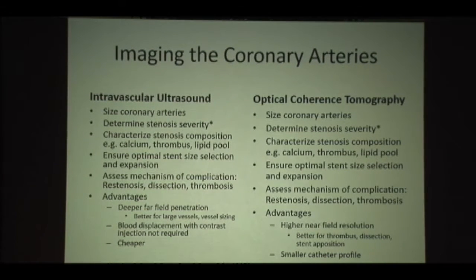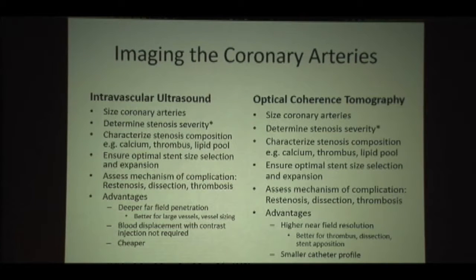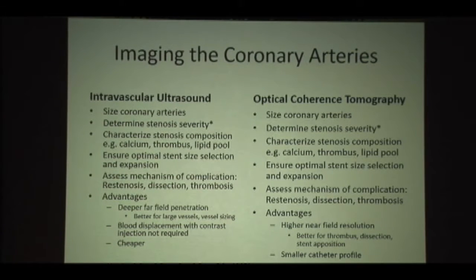Both leading techniques for imaging are very well established, and they share a number of very similar characteristics. You can pick essentially either one of these. They both will allow you to size the coronary arteries so that you're selecting the appropriate device for treatment. They'll allow you to determine severity of stenosis. Specifically today, most will agree an MLA of less than 2 to 2.5 for the major epicardial coronary arteries is consistent with obstruction, or for left main disease, an MLA of less than 6 millimeters square.